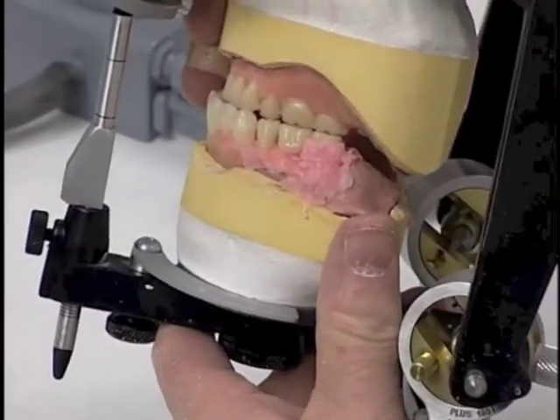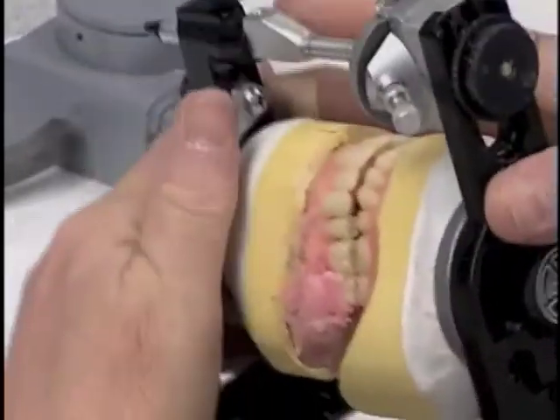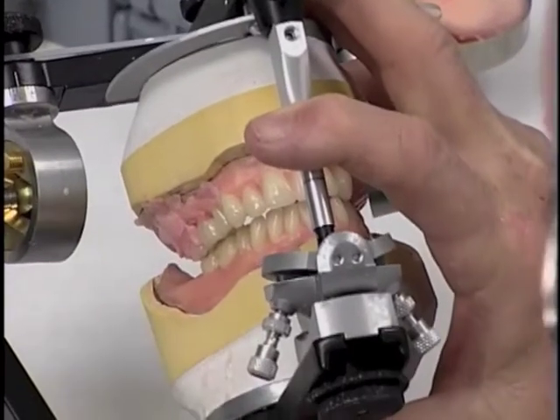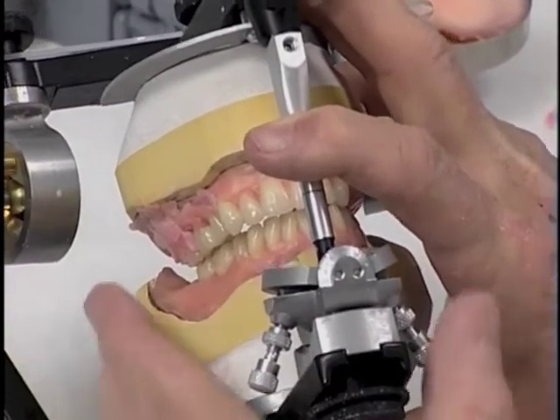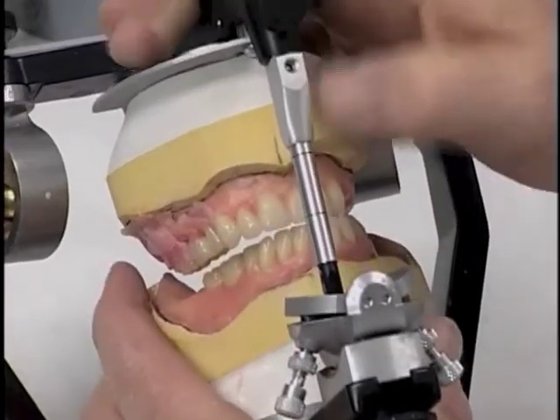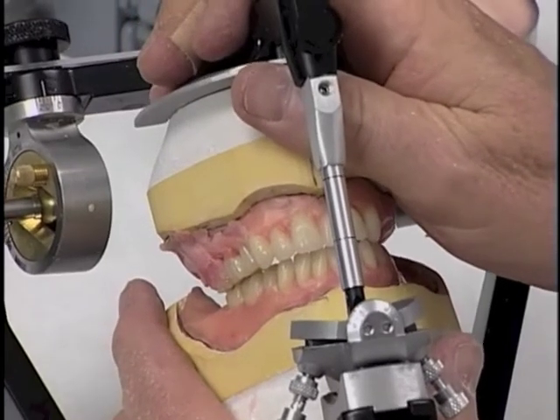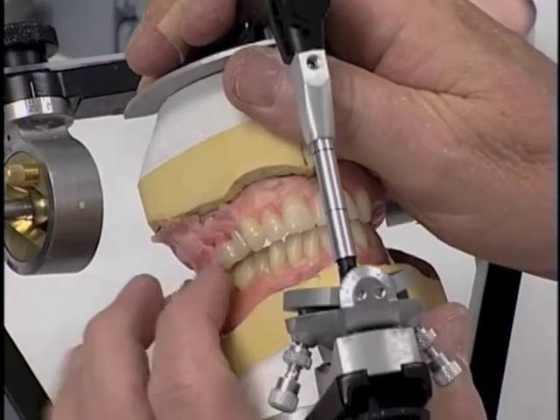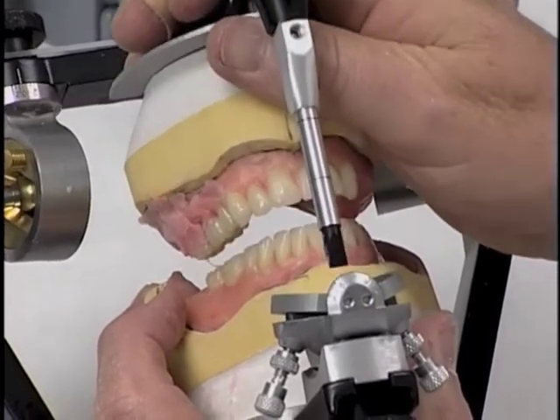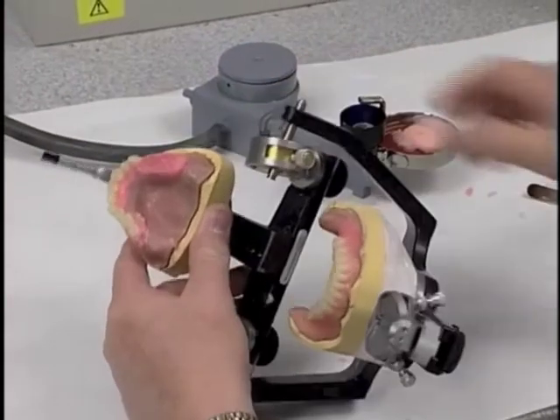Now we're getting to the point to where we're getting good occlusion with that. We also have a good horizontal overlap to the teeth. That horizontal overlap should be approximately 2 to 3 millimeters. That's in order to keep the patient from chewing their cheek in the finished product when the dentures are delivered. So at this point, that quadrant looks pretty good. It may have just a little excessive right there. And we can stabilize those teeth right there. That quadrant looks pretty good.